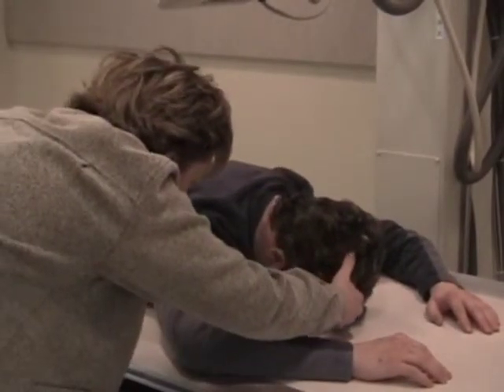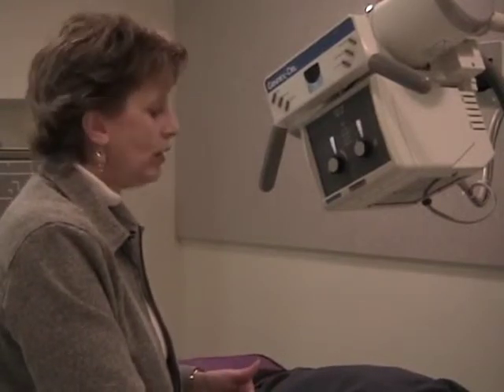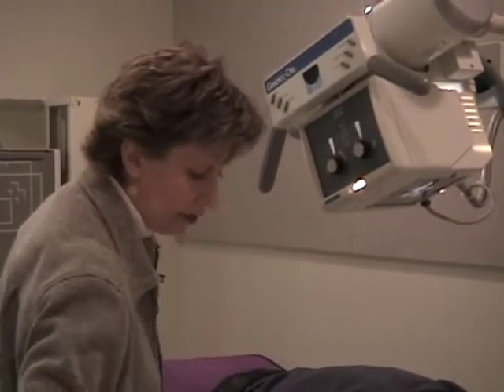That's good. And now with an axial, I must have a tube angle. For an AP axial, the tube angle was caudal. For a PA, the patient's reversed. We've talked about this before. Whenever you reverse the patient, you reverse the angle direction of the tube. So I'm going to have a cephalic tube angle, and I'm going to have 25 degrees cephalic. And where I want it, I've got it exiting to the center of the film here.